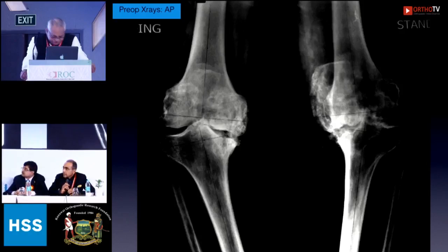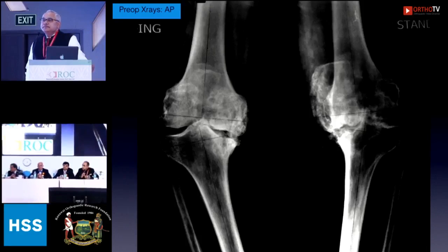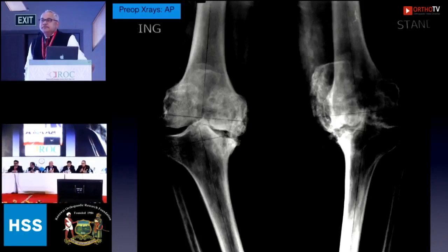Yes, perhaps. So I think the take-home message is I would probably do a 6 to 7 millimeter cut on the lateral side. Maybe it is projectional and I can't see very well, but these are the cases where you want to start off with thinner cuts than usual.